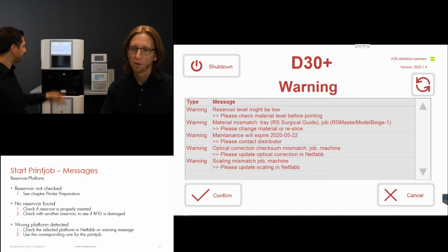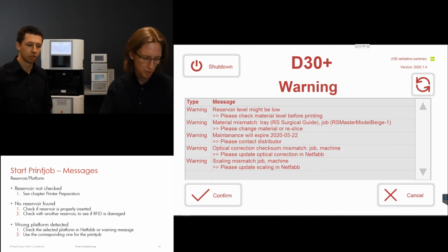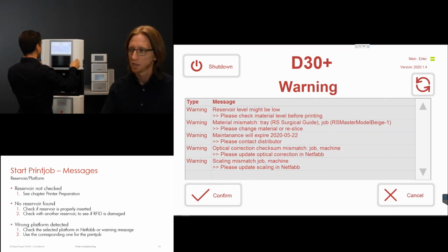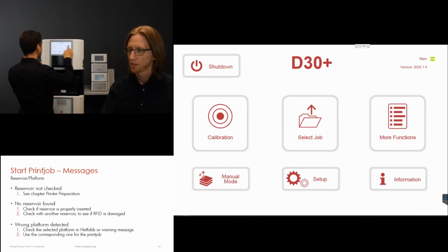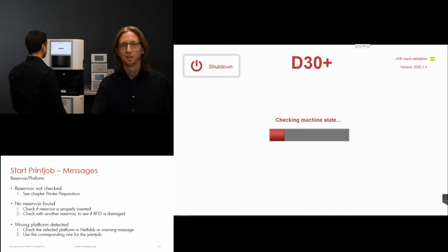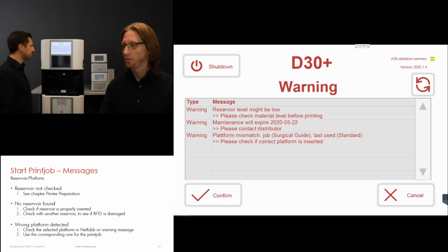No reservoir found. You've seen it was with the reload button or the refresh button. All right, so that looks good. The next thing would be the wrong platform actually. This is something which we will see in a minute, as soon as Robin has started the prepared job, where we would like to show what's going on.